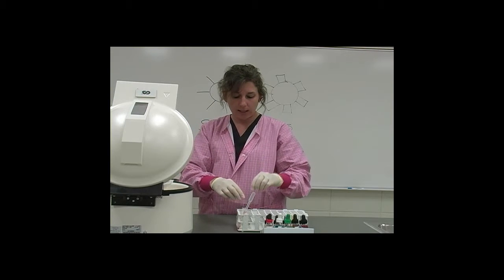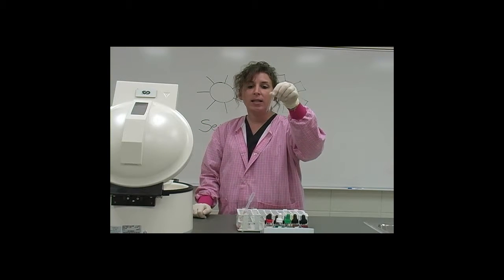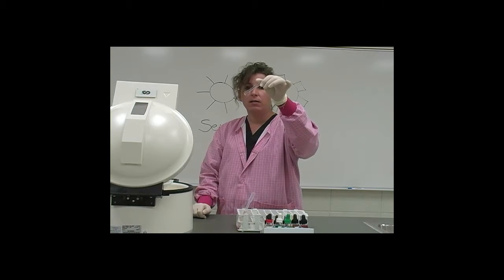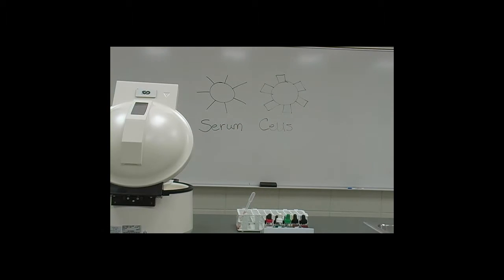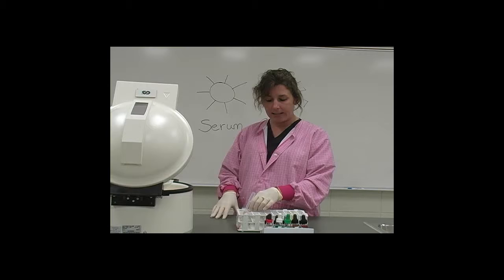Okay, so what we're going to see here, let's take a look at the first tube we have, and that is going to be our anti-A tube. If we give it a brief shake, we will notice that we do not have a clear drop of blood anymore. It is depicted by that of a clot. I'm going to step around here a little closer for you to see. And you can see here we have a rolling clot in the tube. So that would be a positive reaction for our A tube.